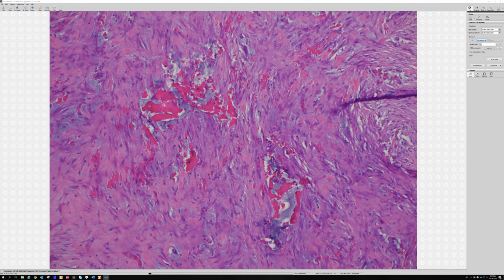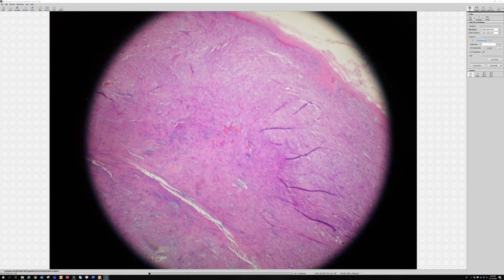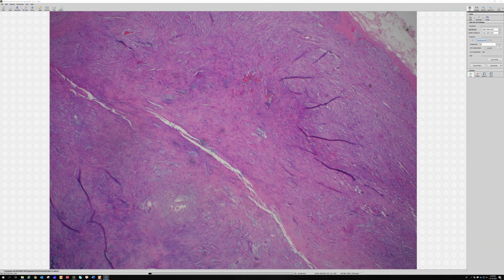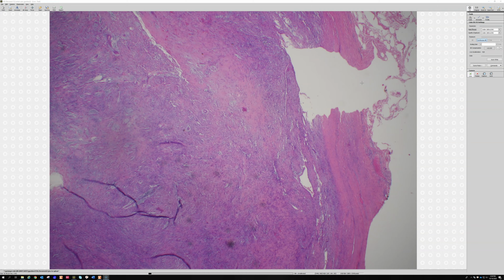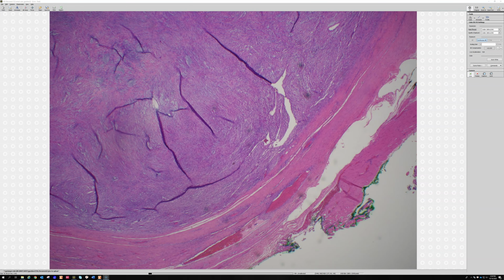And there's an example of tissue culture plus myxoid cystic degeneration plus hemorrhage, extravasated blood cells plus keloidal collagen, all the stuff in one picture. Nodular fasciitis. Because of the mitoses, sometimes people get concerned, especially with the early cellular lesions of these, and can overcall them as sarcoma. And that's really important to not do that for obvious reasons.